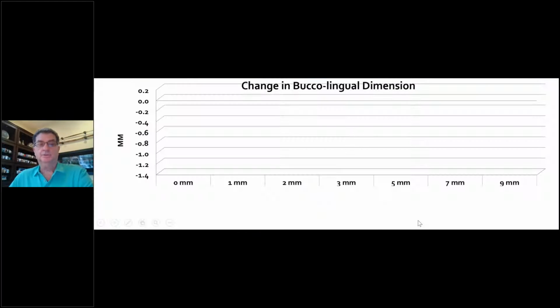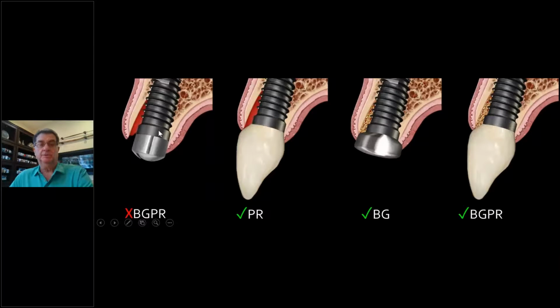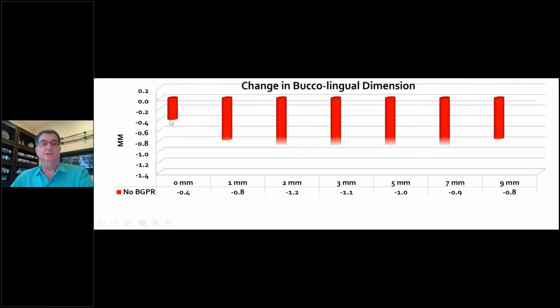So we looked at this, let's take group number 1, just the implant. Now, Uli Grunder showed 1 millimeter change when he did this, buccolingually, after 6 months. So this minimum 6 months data, what did we show? We showed 3 millimeters up, which is about where the top of the implant would be, and what he measured, we had 1.1, almost identical, beautiful, 1.1. And so this was very good. So that's exactly a duplicate of what Uli Grunder was showing in Switzerland.